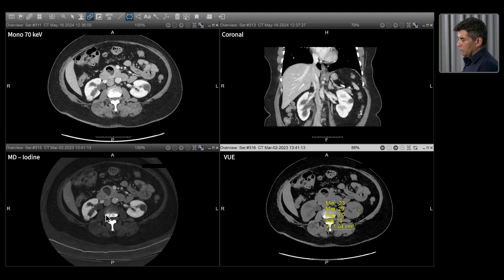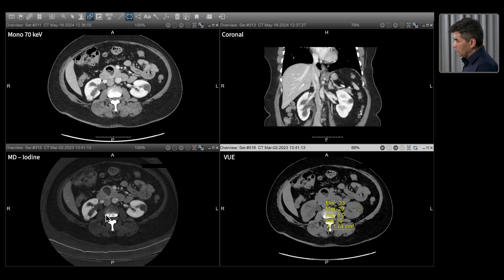The material density iodine images confirm that of all the lesions we see in the kidney, the lesion on the right side is an enhancing mass — concerning for renal cell carcinoma and requiring more investigation. Whereas all the remainder lesions, including the one in the renal pelvis, are all benign and we can ignore them.